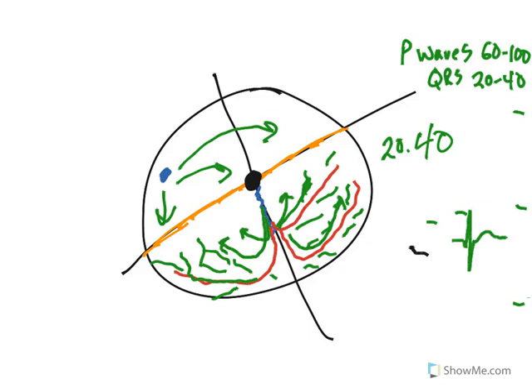Oh, one last thing. You don't need a 12 lead EKG to tell if you have a nodal block, so a first degree or a second degree type 1 or second degree type 2 or third degree. You can see those on a regular old EKG. Regular old lead 2 works perfect for it. But in order to tell whether or not you have a bundle branch block, you have to have a 12 lead. If you only have one lead, that does not tell you whether or not you have a bundle branch block. So, all right, that's it.